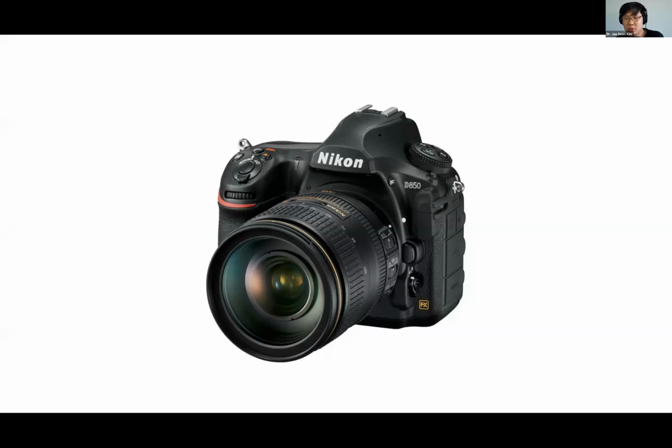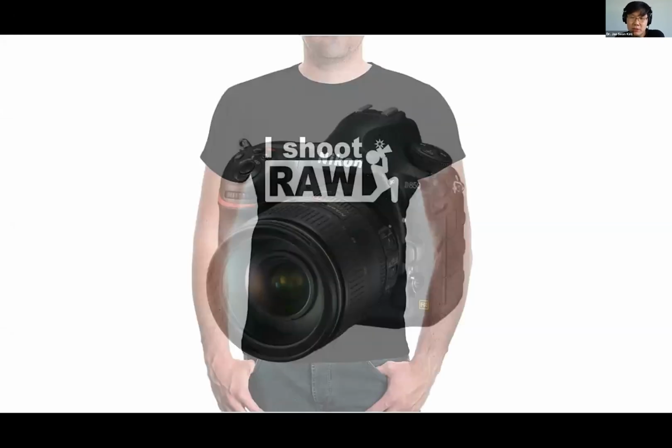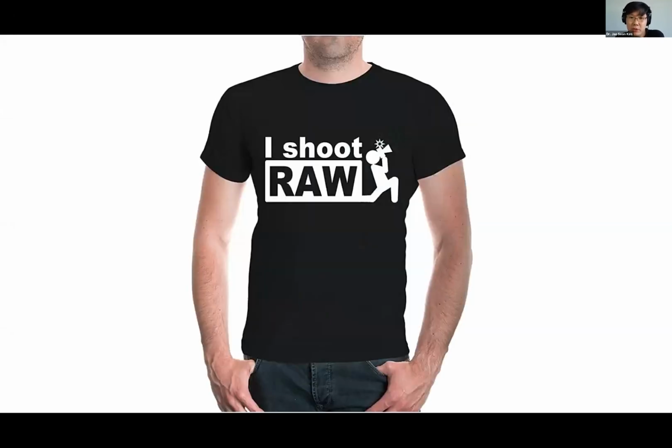I thought about switching to the mirrorless, but the investment of upgrading to a more expensive camera that produces similar quality images may not be worth it for me. So I'd like to stick with the DSLR. But the most important thing is not really the equipment itself, because all these cameras take really good photos. The most important thing is to shoot the photos in RAW form.